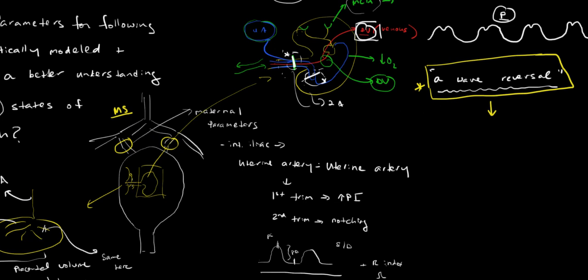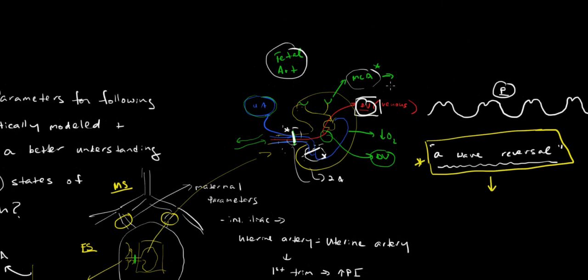And then we also mentioned that one could then look at problems in the fetal circulation, and what one could look at is first the umbilical arteries. People could also look at the fetal middle cerebral artery, which isn't a point of focus because it doesn't directly pertain to placental flow, and they could also look at the venous phase of the fetal circulatory cycle by looking at flow within the ductus venosus.